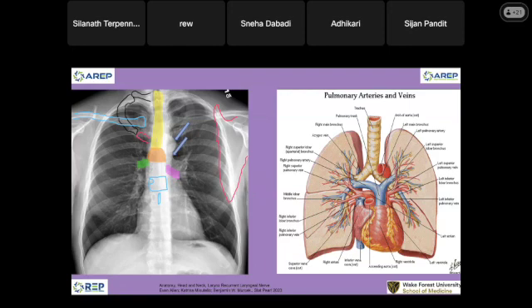This structure is important, that soft tissue, that bone. Let's look at the belly a little bit. There's little structure in there. This is my liver.